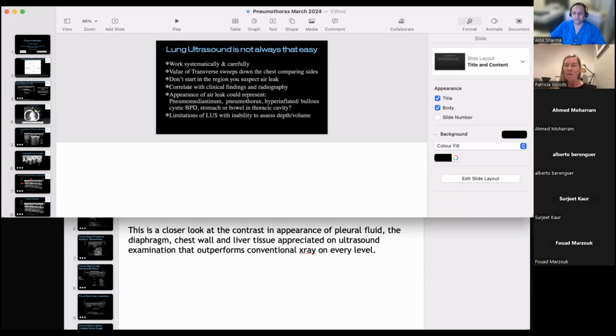Yeah. I think having a conservative nature in some of them, you have to think, does it matter? There's many times I will have a look, you'll have a baby post resuscitation, I have a quick screen of the lungs, maybe a very quick look at the heart, is there outflow tract obstruction, things like that, just questions that help you, and a knowledge of perhaps that there is a little slither of air leak, but move on. So there's many times I will not intervene, absolutely.